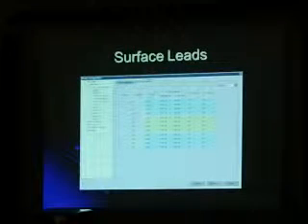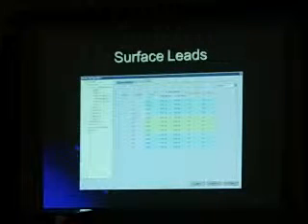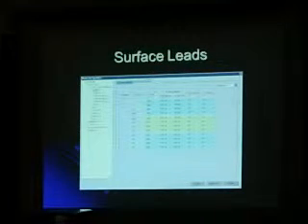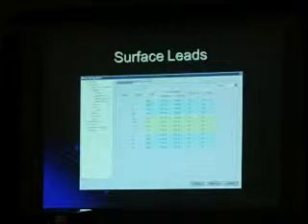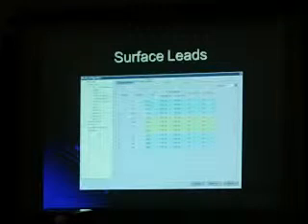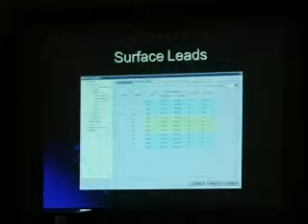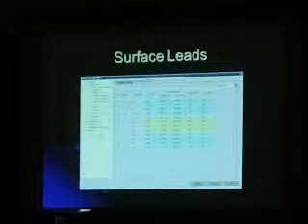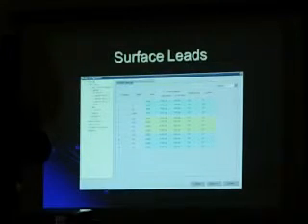Right? But occasionally when it's set at 0.05, we're going to get some of that respiratory variance and it's going to be wandering all over the place. So you can actually up this high pass filter to like 0.5 or 5 hertz, and that will help fix it to its baseline, because that's what that does. However, if you do that, what's going to happen to your P waves and T waves? It's going to flatten them out and make them almost impossible to see.